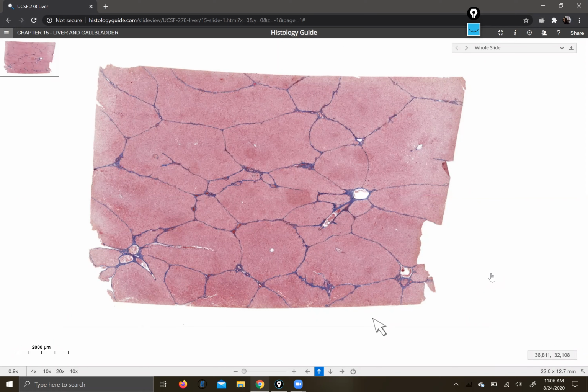Okay, so let's begin. We are looking at a chunk of pig liver, and it's been stained using a technique called Mallory-Azan, and that is a contrast technique. As you can see from the images here, there's blue outlines and it kind of looks like it's tiled almost. That is because the connective tissue that separates the liver lobules is stained blue in this stain. It's nice because it makes them easy to see. Here's why that's good for you.